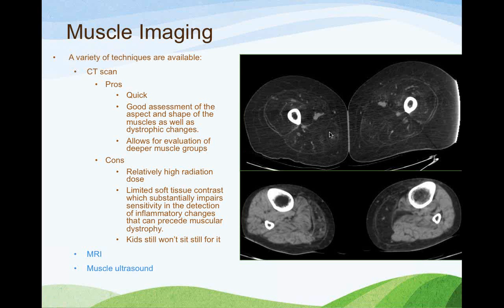The fascia layers are essentially similar to what you see in chicken when you're trying to cut it, where there's a layer that's a very clearish white membrane. It's a similar type of thing, and it segregates the muscles into different groups so they can perform different functions in different directions. So you can see distinguishing fascial boundaries throughout the muscle here, but it's not super clear. But what you do see is that here you have bone, here you have muscle, and above that, sorry, here is what we call subcutaneous fat, and then above that is skin.